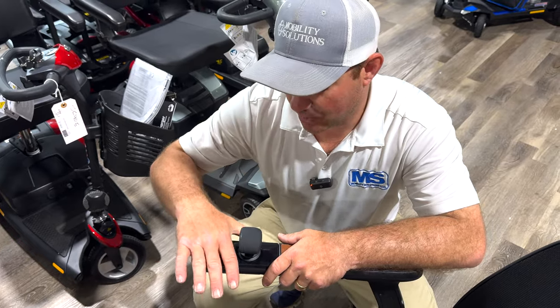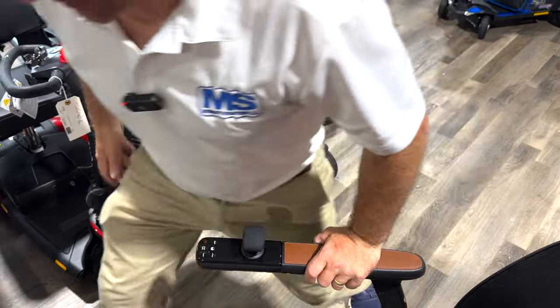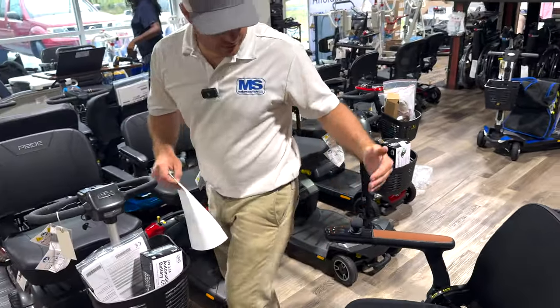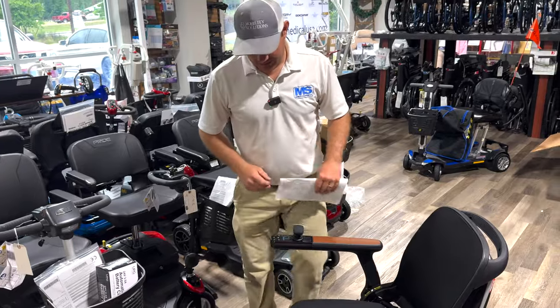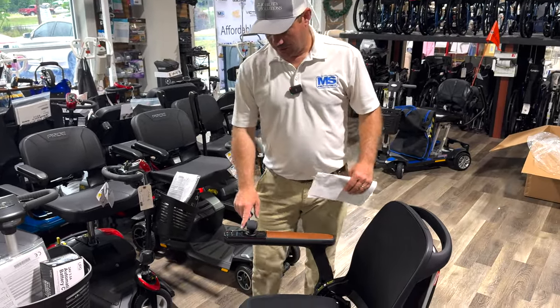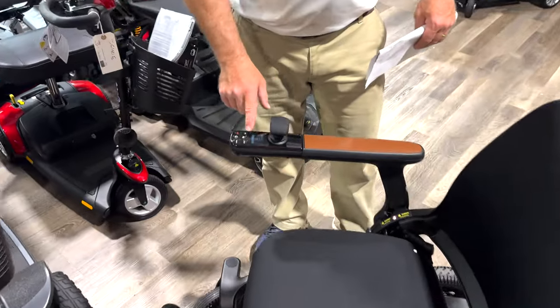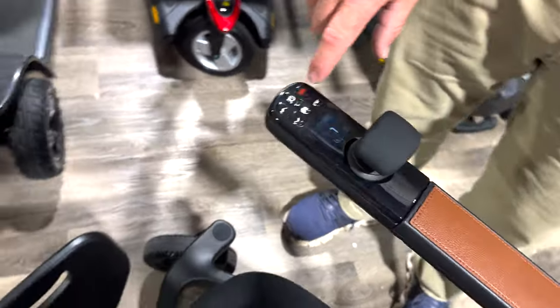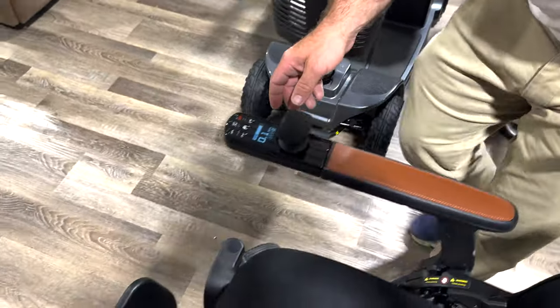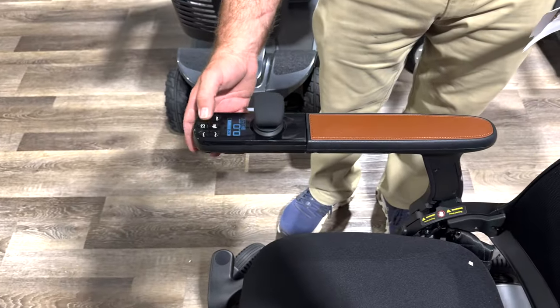So the nice part about this, when you can get up out of these, you don't have to worry about pressing a button and it's going to take off on them. Even if it turns on, just like that just happened, it's automatically going to be locked. So in order to unlock it, it has a lock button right there, press that again, that unlocks this power chair to operate. Now, that's on speed 5. We're going to bring that down to speed 1.